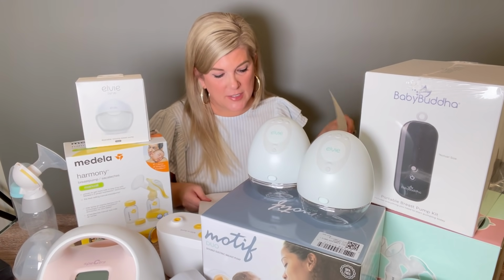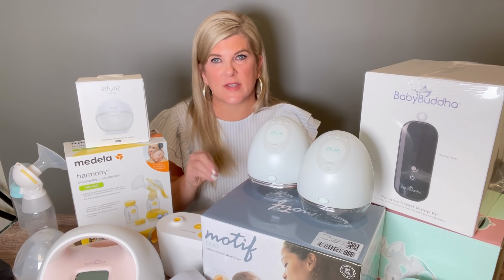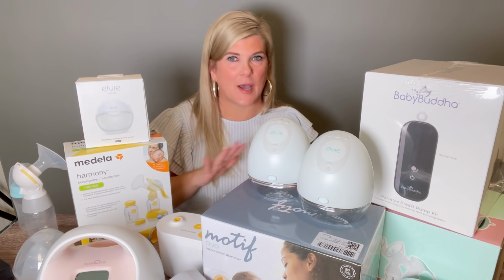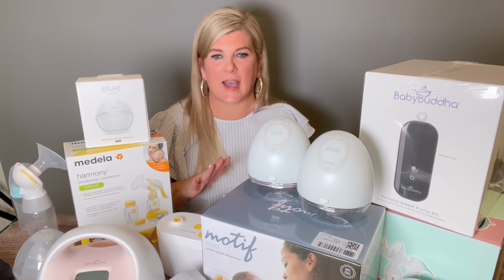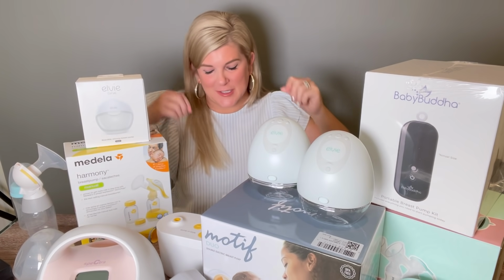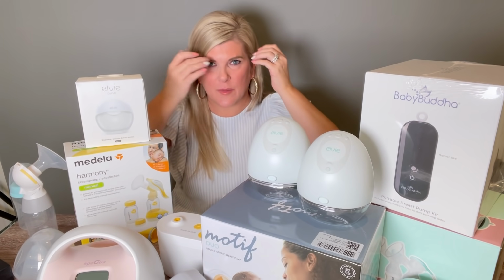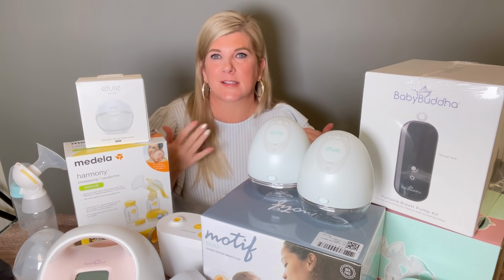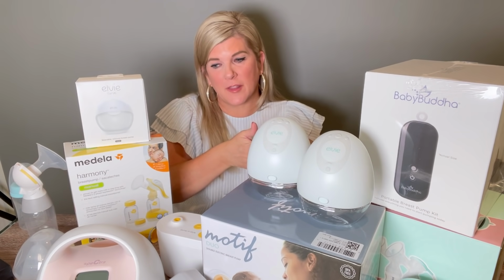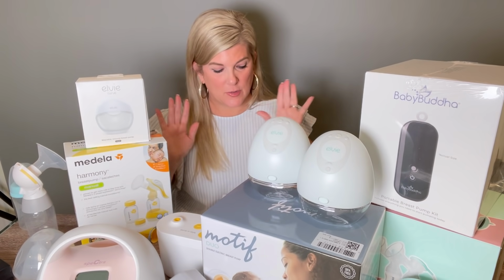But just a quick tip, what's always important is to use the pump on the lowest setting that's comfortable for you, not the highest. The highest setting does not mean that you're going to get more milk. And again, a lactation consultant would be really upset if you were just like, let me crank it up and get the most milk possible. It doesn't work that way. It actually could have the reverse effect. So it doesn't speed up the pumping process. So you're going to go from turning on the pump to letdown mode to expression mode. So I hope that helps.